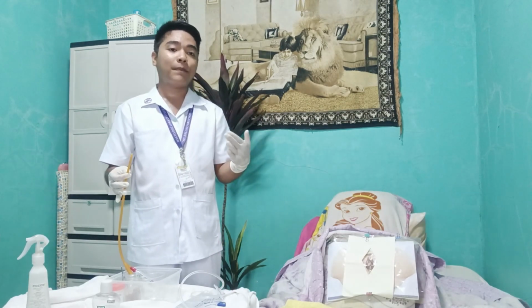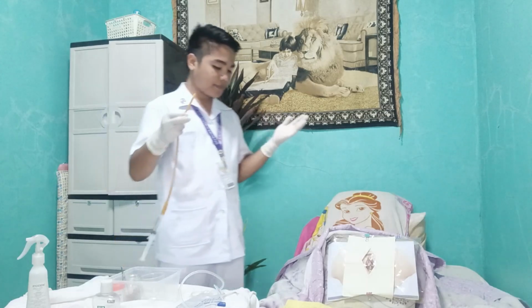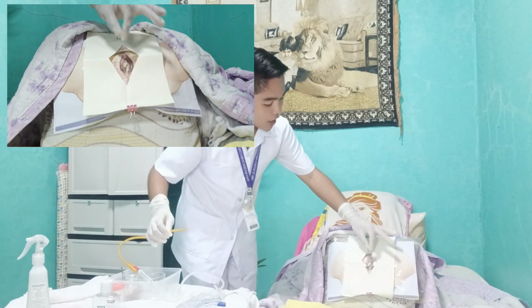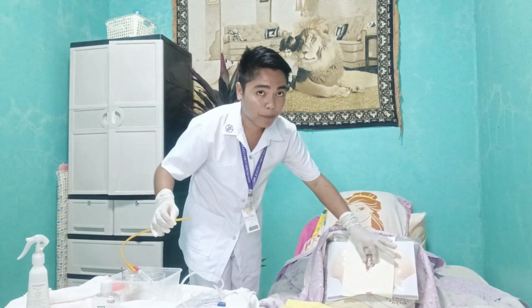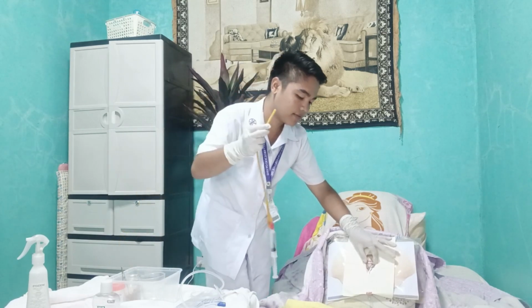Here in my tray, I am going to pick up the catheter with one hand and, with the other hand, separate the labia minora of the patient, exposing the area surrounding the meatus. So I am going to insert the urinary catheter. I will separate the labia minora and then pull up so we can properly see the opening. So let's insert.